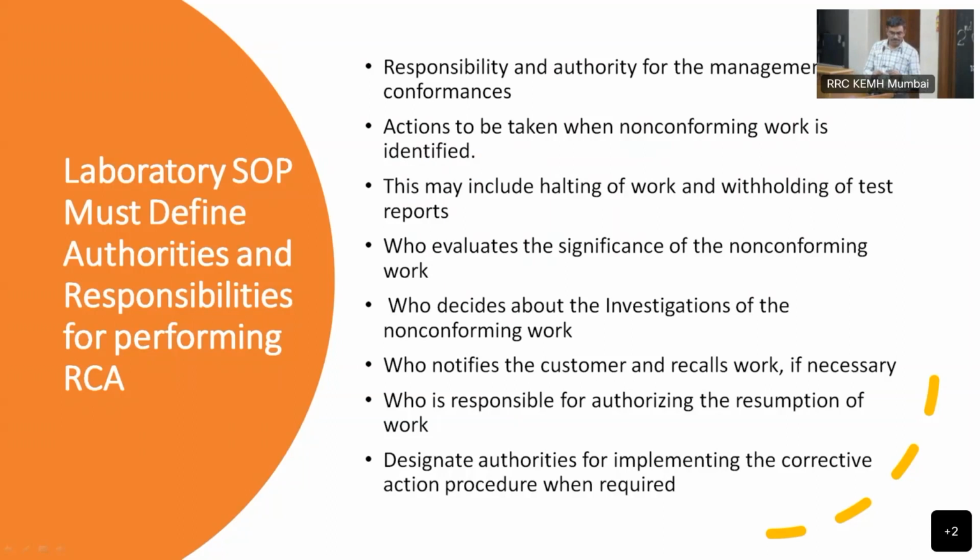तो 20-25 सैंपल का एक बैच बनाते हैं. We prepare a batch. Okay. Run time of one sample is 8 minutes. Okay. So when we load the sample and give a command, okay, we have to select a method for each sample. Okay, method is validated method.